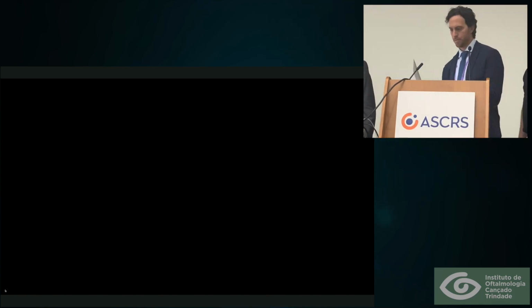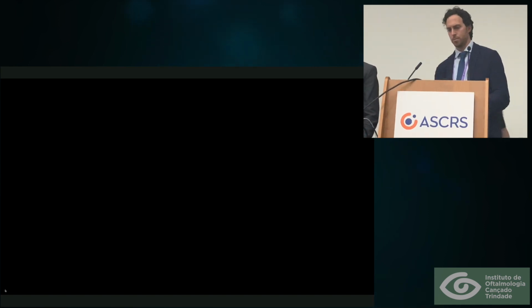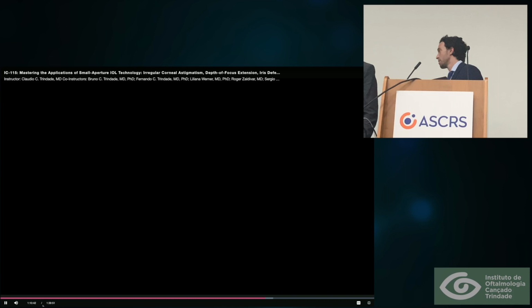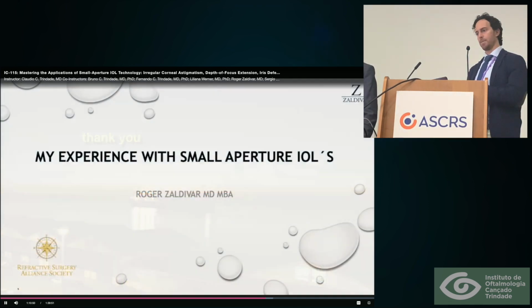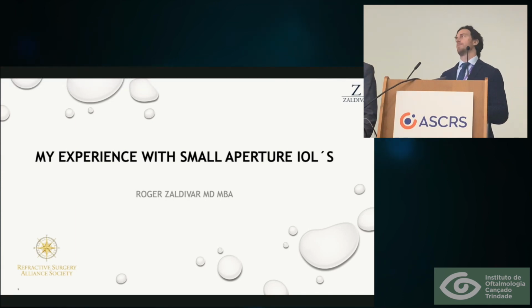The difficulty to implant the lens in the bag is because of the size or because of the view? And otherwise, you recommend that it can be implanted in the bag? Well, whenever possible, I think in the bag will guarantee a better long-term stability in terms of centration. We know that sulcus IOLs are prone to slight decentrations over time. So whenever this is being considered during cataract surgery, I think it's easier and better to implant it together with the IOL inside the capsular bag.